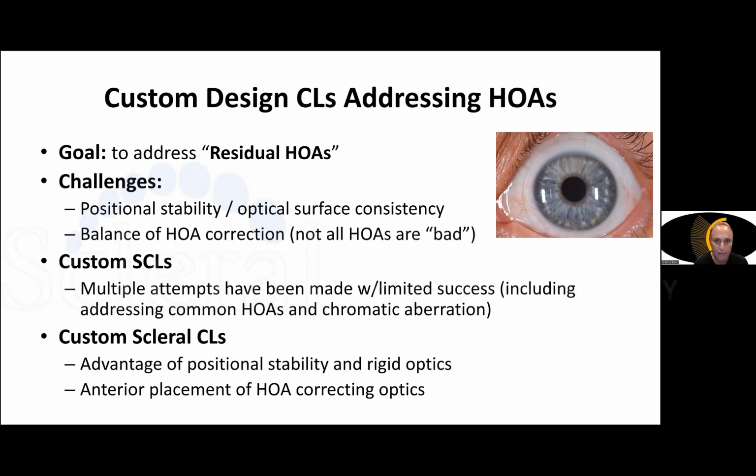Now, many of us have used custom soft lenses, and some of these have actually been designed to specifically address high order aberrations. I've been involved in about 3 clinical trials for them with very limited success. I think the biggest problem is getting a consistent surface, consistent rotational stability and such. Of course, custom scleral lenses have the advantage of positional stability and rigid optics, and we can place the high order aberration correction optics on these lenses because of their stability.